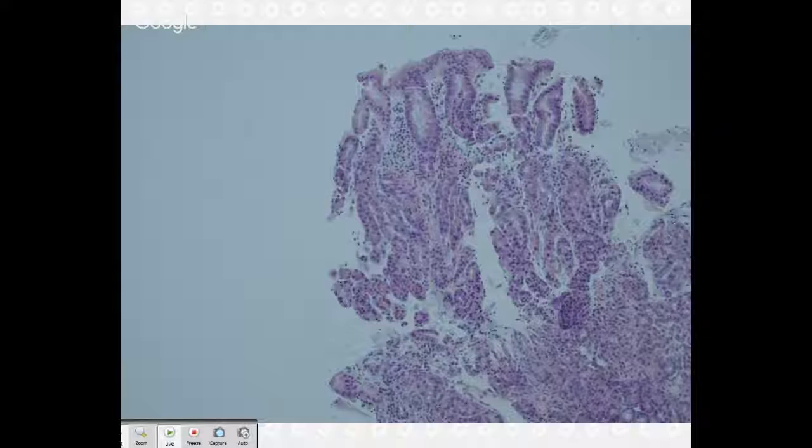And so in this woman, we found out that she did, in fact, have an ovarian malignancy. She had just gotten a dose of her chemotherapy. You can see these changes for up to about 2 weeks after your dose of chemotherapy. So in this patient, this is a normal response to the chemotherapeutic agent that she received. So you don't have to worry about it. Our answer back to the consultant was no, this is just reactive. This is due to her drug. It's a drug-induced change. You don't need to worry about it, not malignant.